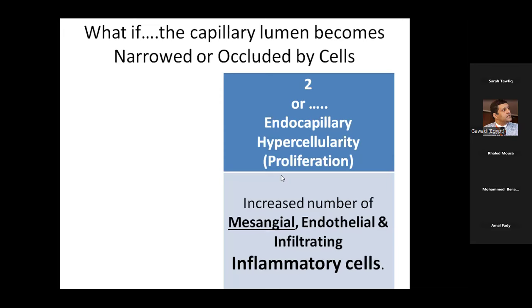As a start, I would like to highlight something else: the mesangium and the endothelium are considered one compartment, which is the endocapillary compartment. What does this mean? That's why I am underlining the word mesangium.